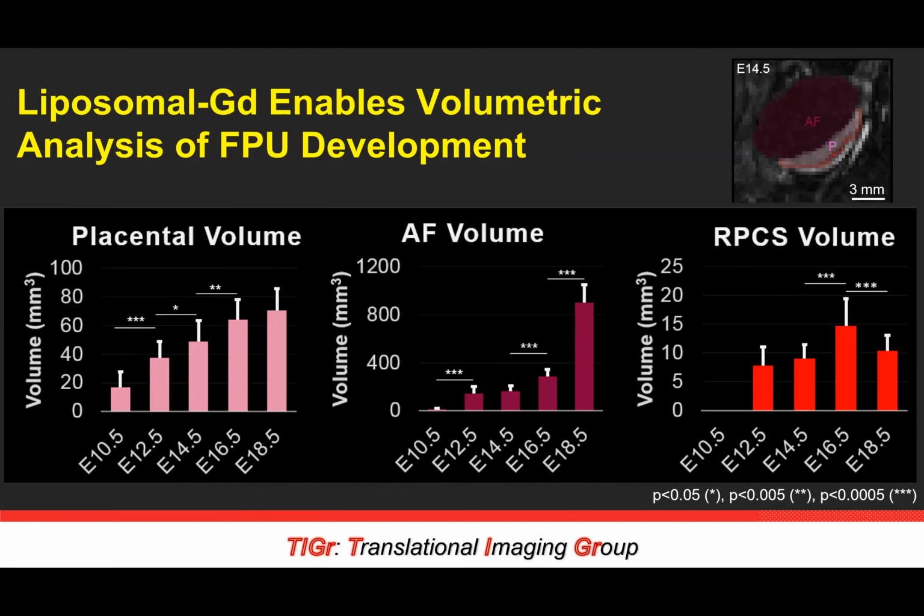We have some theories. We think that possibly as this amniotic fluid compartment is growing, there is potential compression, but it's difficult to say, especially given just the number of spiral arteries traversing that region and questions about the compressibility of that space. But that's still ongoing work in our lab to try and answer that question, which we find very interesting.